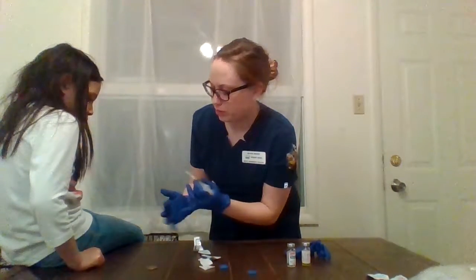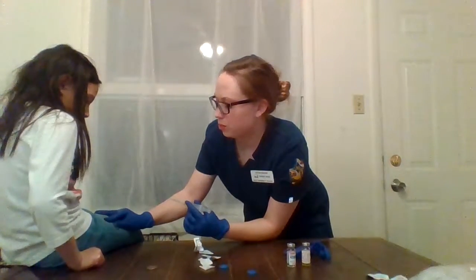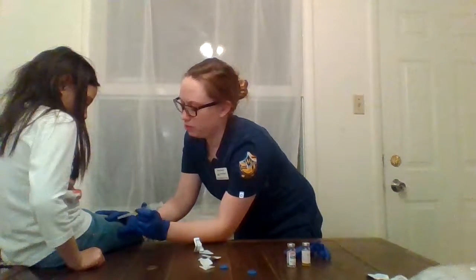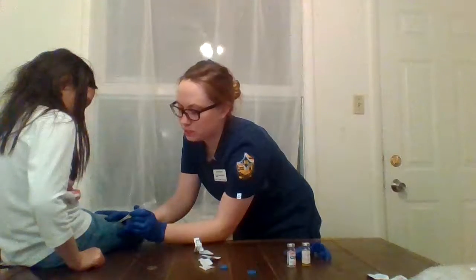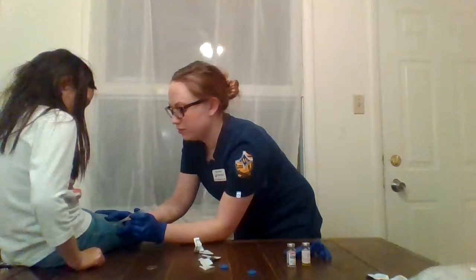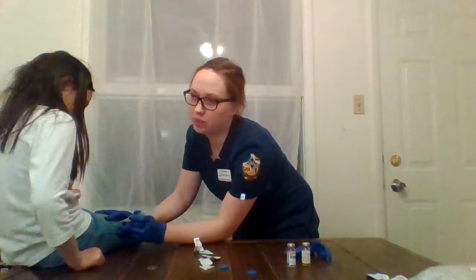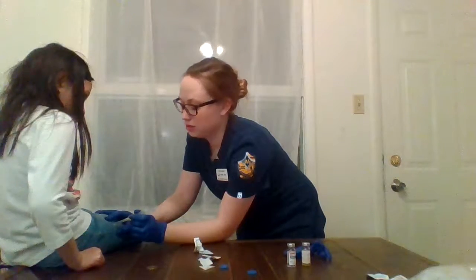Instead of pinching up the muscle, I'd be holding the skin tight, pulling the muscle down. I'm going to inject the needle. I'm going to actually aspirate to make sure that I don't draw any blood. If I were to draw blood, I would pull out the needle, draw up new medicine, and start again.